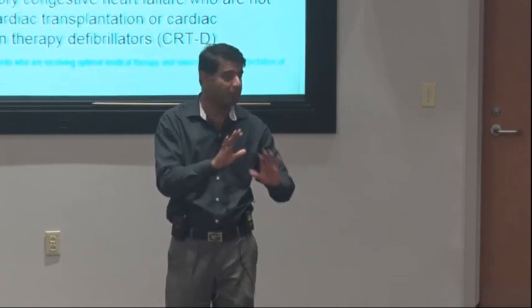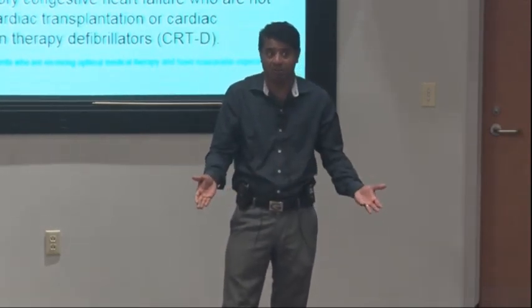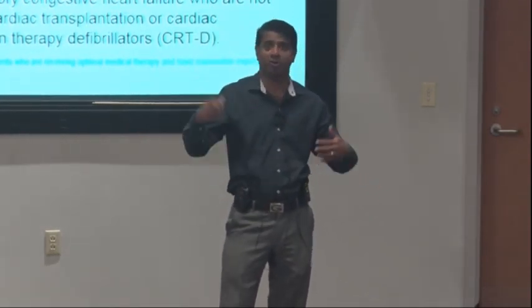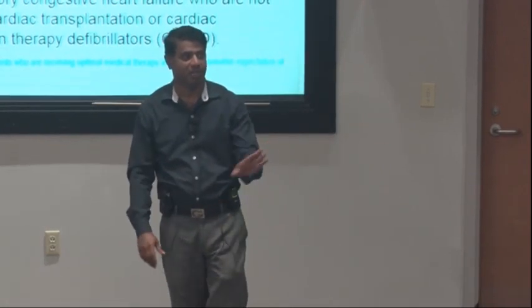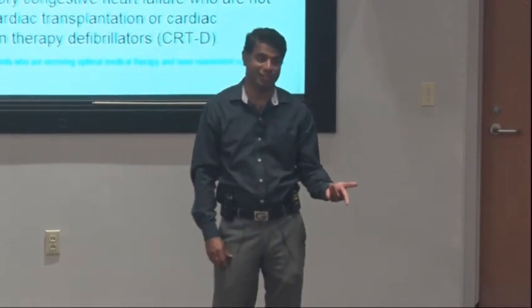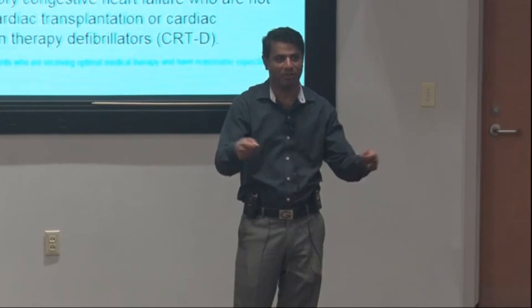It's a very good clinical question. I don't think it's a board question, but it's a fantastic question for an internist, because you are a hospitalist sitting there, you'll call cardiology, the fellow is somewhere, somebody calls and puts a magnet. He's not going to get a shock. But you want to make sure that it's enough, you don't want to put a magnet and he's in VFib. Then you'll be shocking from the outside.